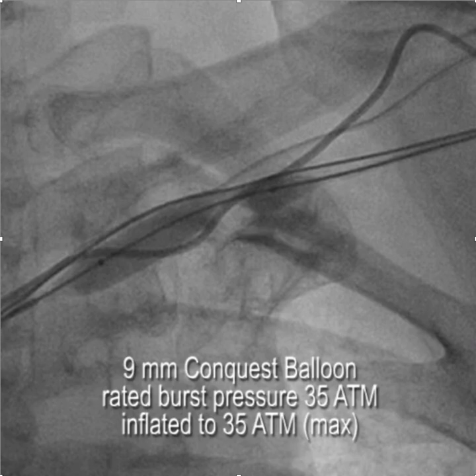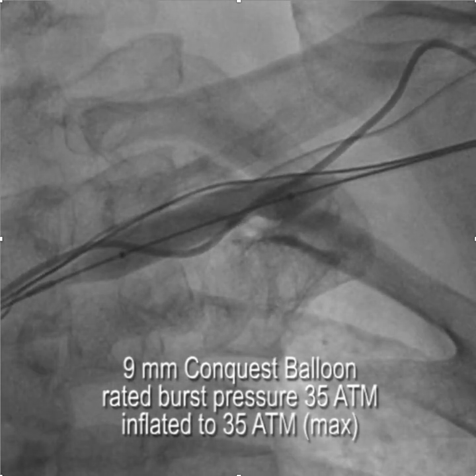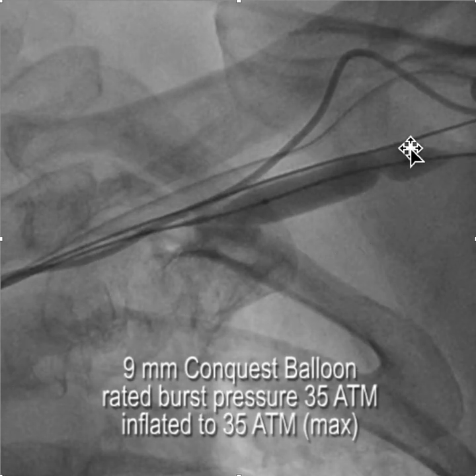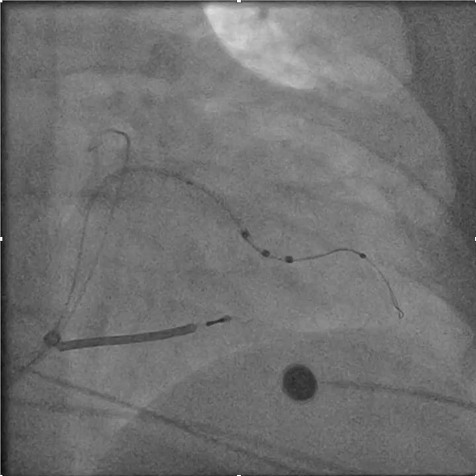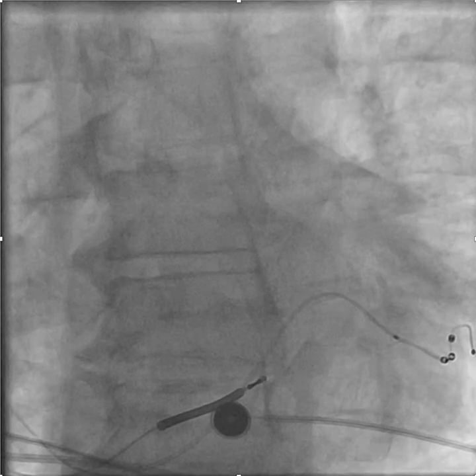Here we have the 9mm Conquest balloon, again inflated to its maximum pressure of 35 atmospheres — the inflation device only goes to 35 atmospheres. With this, we finally get the stenosis to go away. Remember, you want to make your final inflation so that you can see the tail of the balloon in the pocket. From there, the implant was relatively straightforward using Amplatz support wire and the usual vein selectors and subselectors.